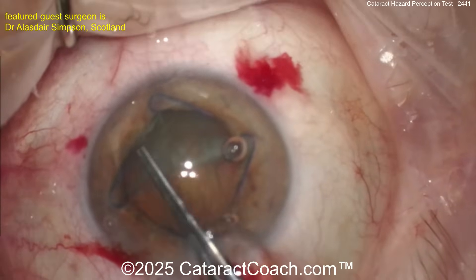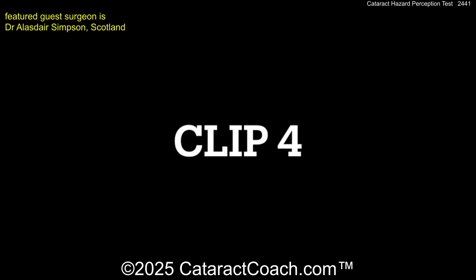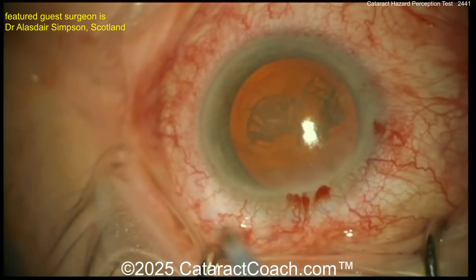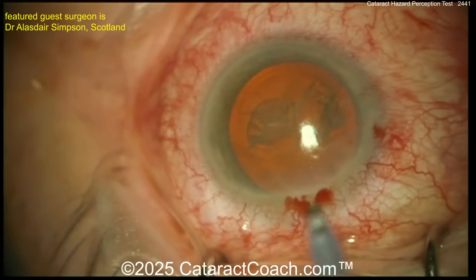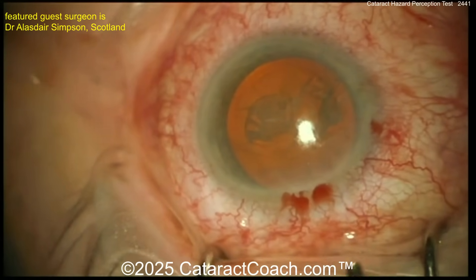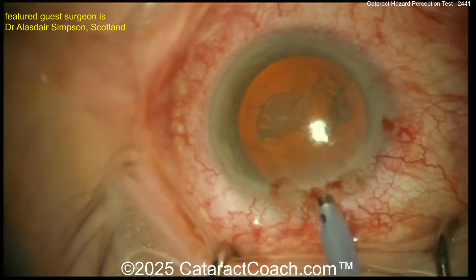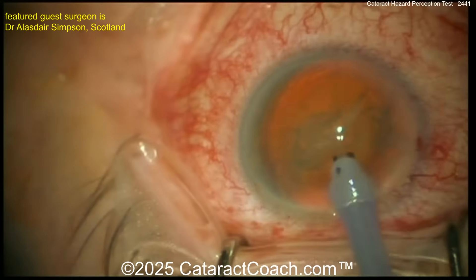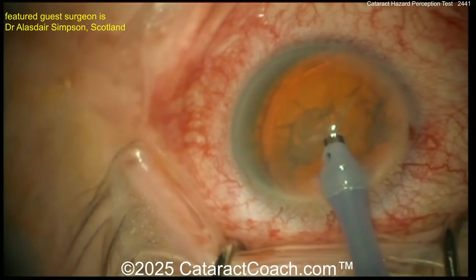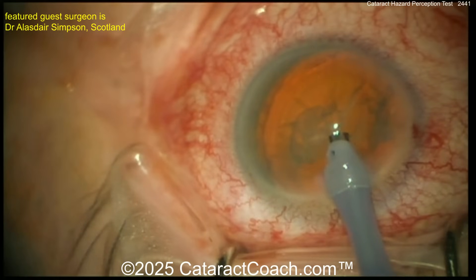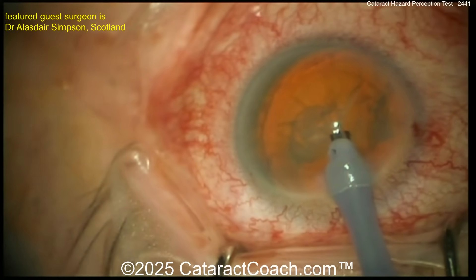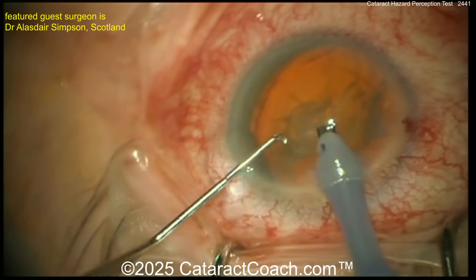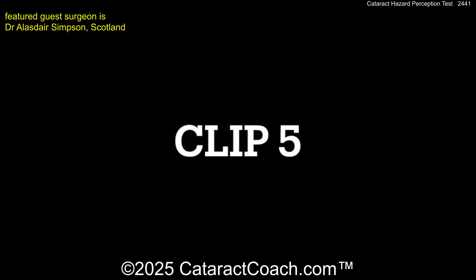If you don't want to hear the answers, just mute the audio and go through the rest on your own. Clip four — it looks okay, eye looks like it's in primary, rhexis done, incisions look reasonable. A phaco probe going inside the eye — and then, whoa, what just happened? High myope, maybe prior vitrectomy — that was a reverse pupillary block. As soon as you put the probe in the eye you saw it. Use that chopper and tent up the iris temporarily; it'll fix it.